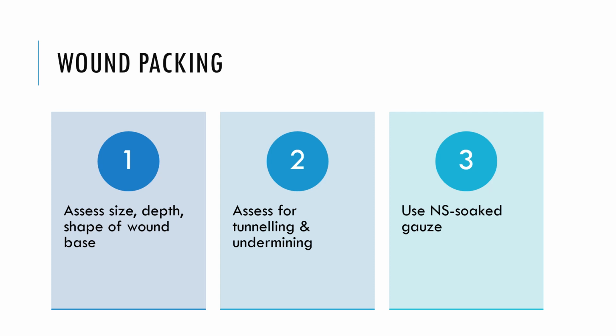Do not pack too loose or too tight, because if you pack too tight, you're not leaving any room for the tissue to granulate. And if you pack too loose, then the packing would not serve the purpose of extracting the exudate.